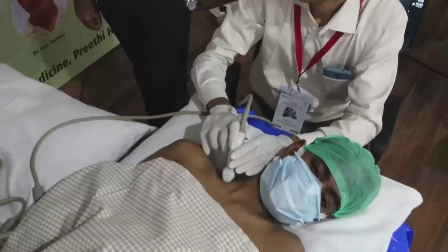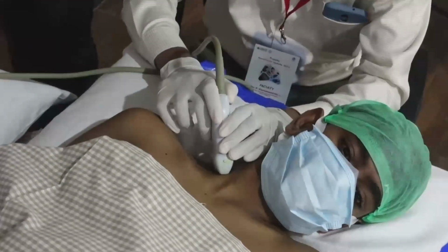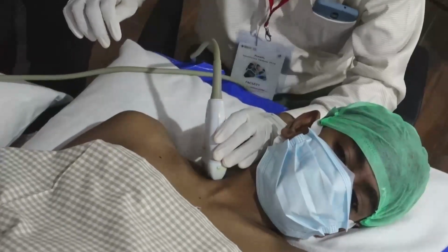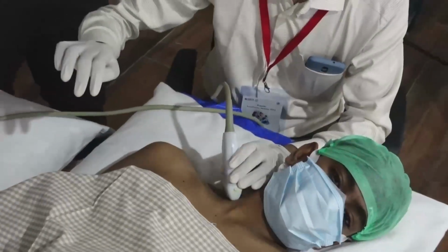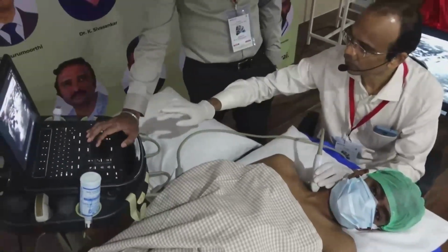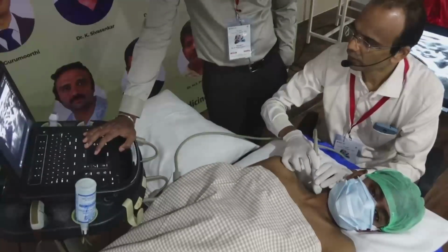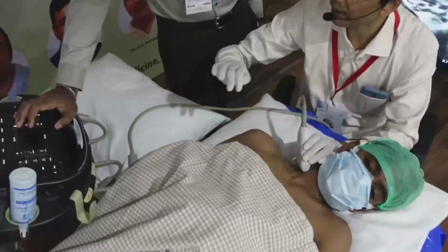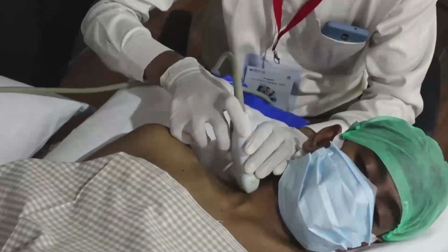Now we have seen some of the anatomical variations also. Here also, if you see, there is a lot of gap. The idea of systematic scanning is that there is so much gap between C5 and C6 component. So if you move the probe cranially, the C5 component is moving and going towards the anterior superior surface of the anterior scalene.